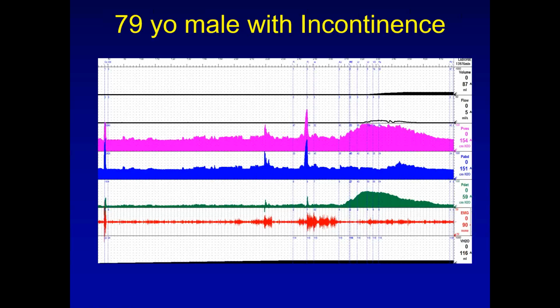If you know about artificial sphincters, in order to void, he has to squeeze that little device. He didn't have a chance. In fact, the urge came upon him, and he leaked. This is an identification of an unstable contraction that caused him to leak through his sphincter, which is going to happen because sphincters don't stop everything.